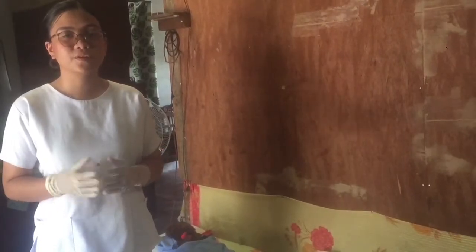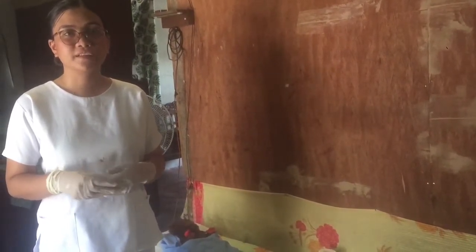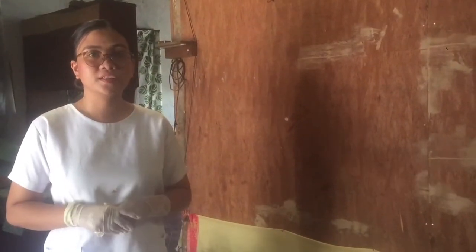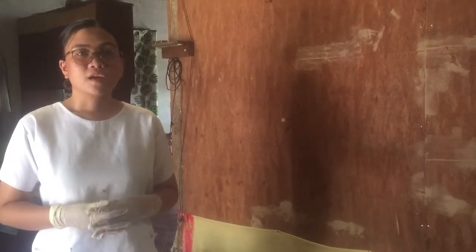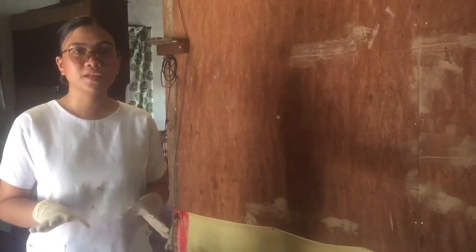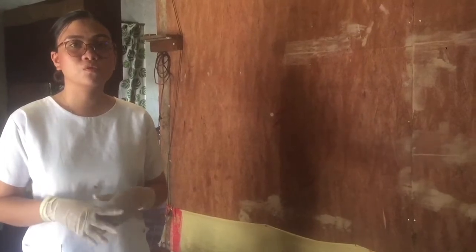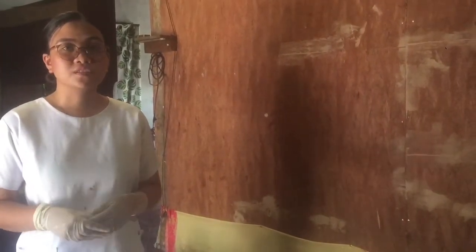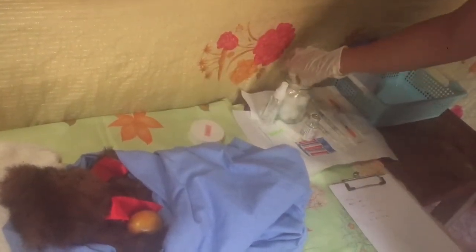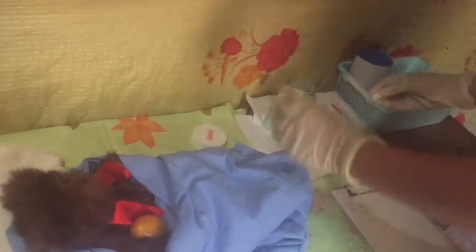Selecting a site where you are going to administer the vaccine, make sure to identify that it is free from any lesions or scars, and make sure that you clean the site where you're going to inject in order to eliminate any kinds of pathogens on the skin of the infant, and of course to reduce the risk of infection. Make sure to clean the site of injection with warm water and not alcohol.